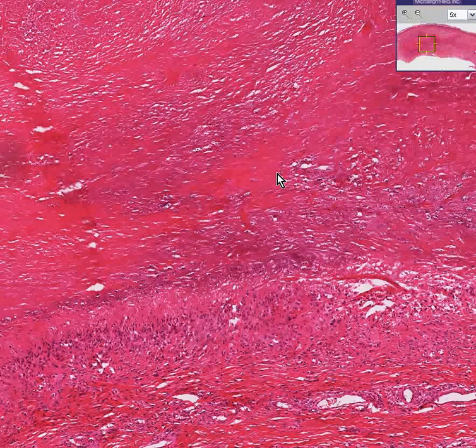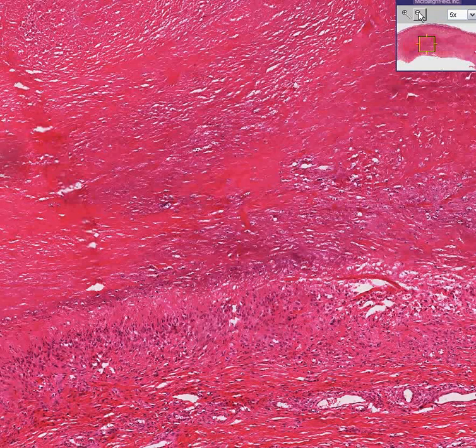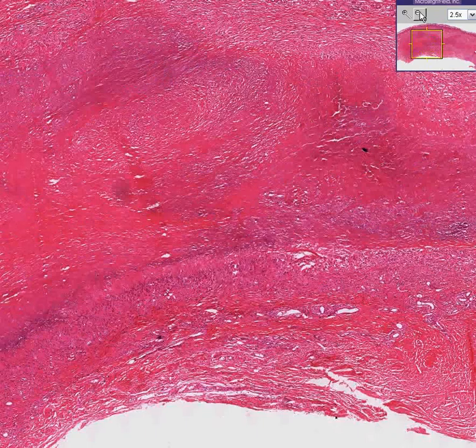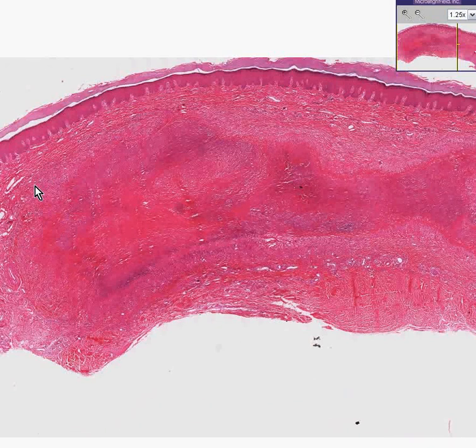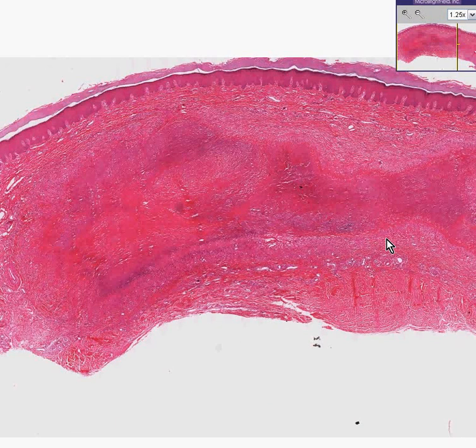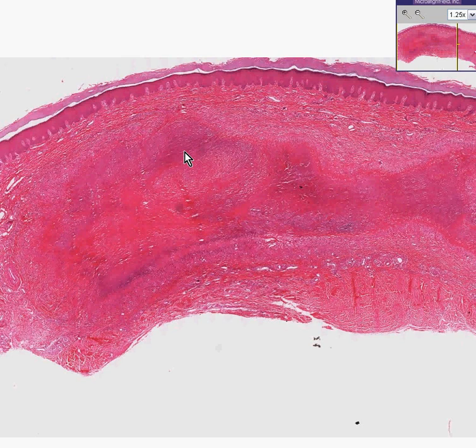Rheumatoid nodules can be seen in people that have rheumatoid arthritis. They can be seen in people that have rheumatoid arthritis in which there is no connection or association of these things with the joints themselves. They can be seen in the lung. They could be seen in soft tissues. In this one, you're looking into the skin and subcutaneous area.